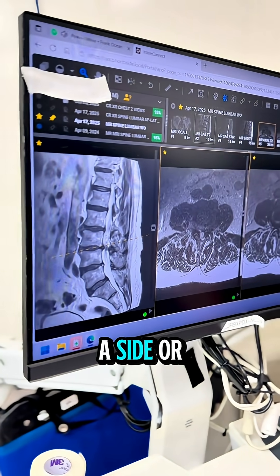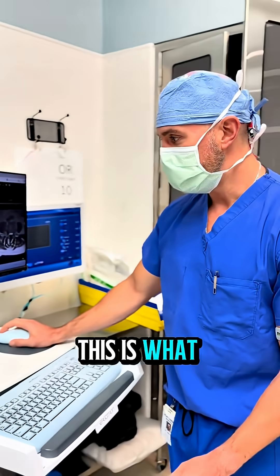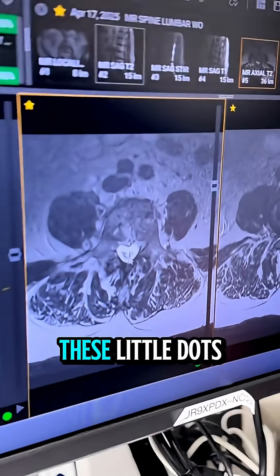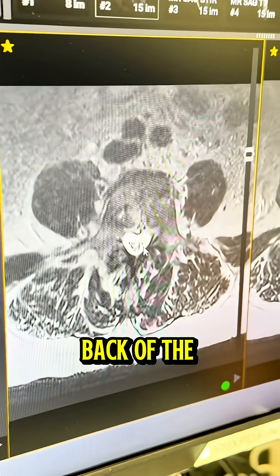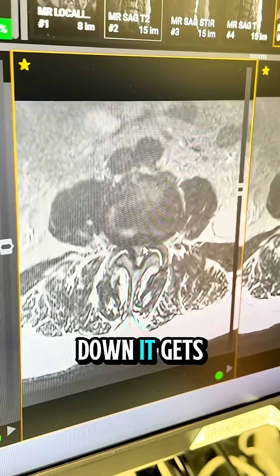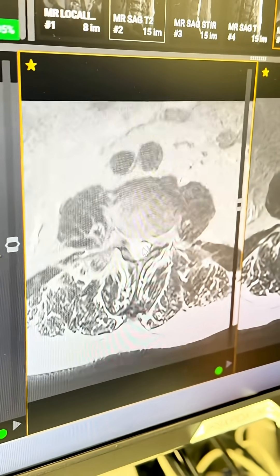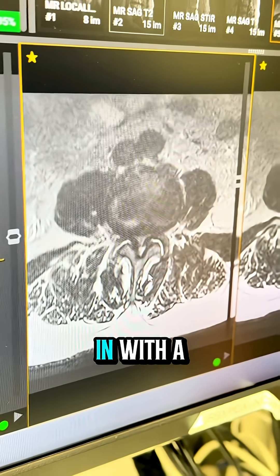The sagittal view is looking at you from the side, a profile view. This is what relatively normal looks like — you can see these little dots, which are your nerves. This is the front of the spine, this is the back. As you come down, it gets very very narrow where you don't see any of that white anymore, and then it kind of opens up again.